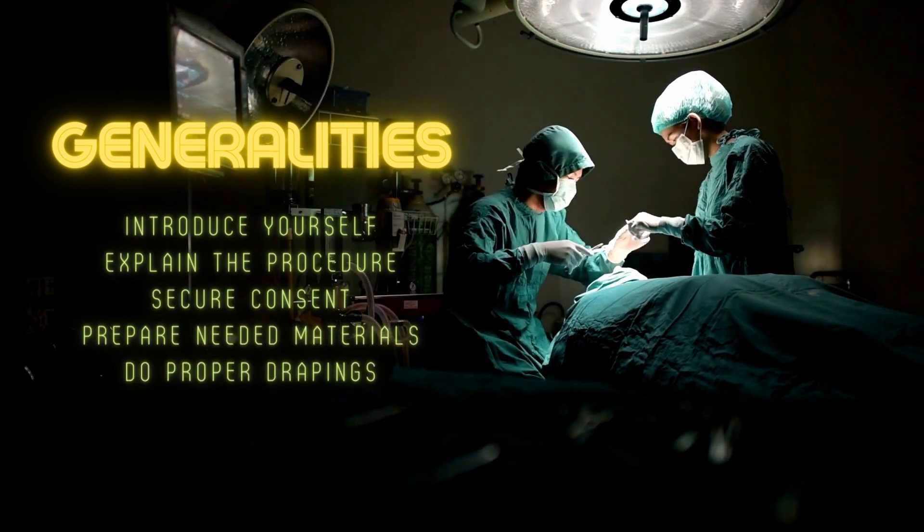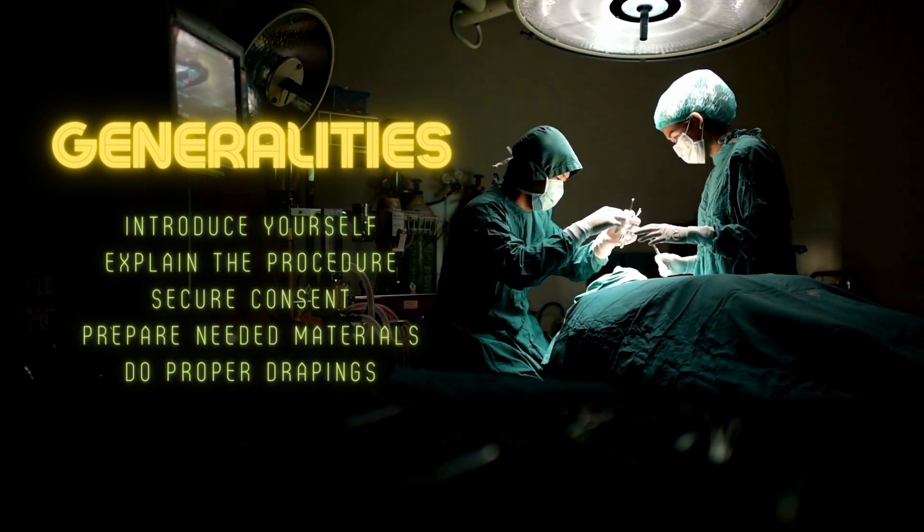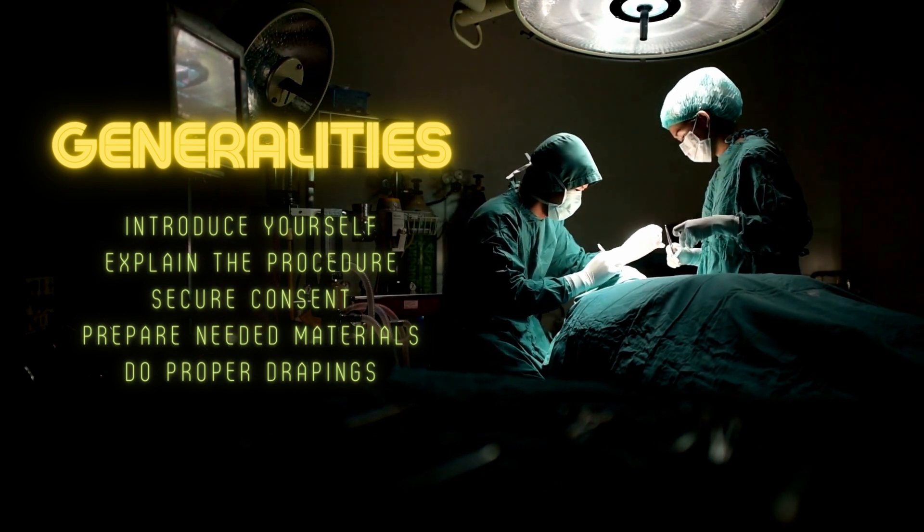Before you start, introduce yourself to the patient and explain the procedure. Secure consent and ask for allergies.